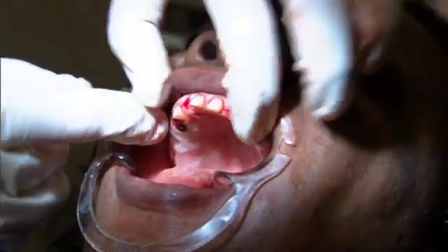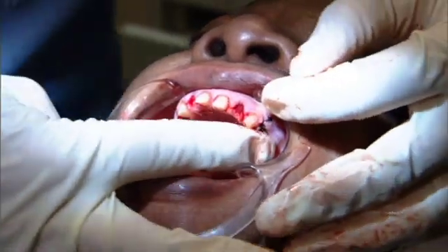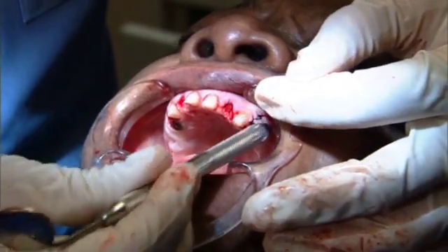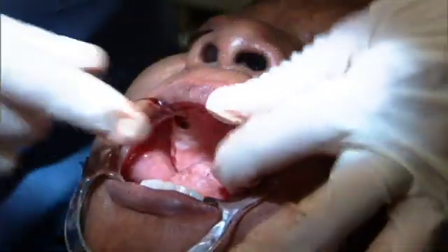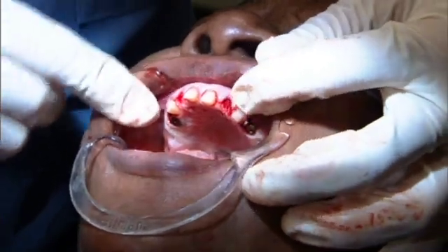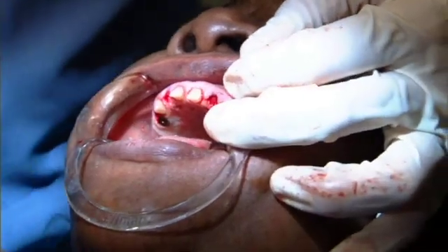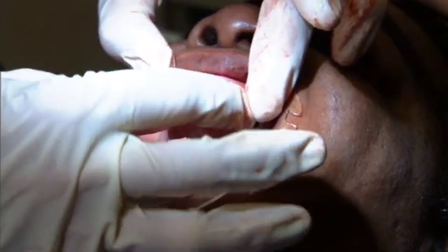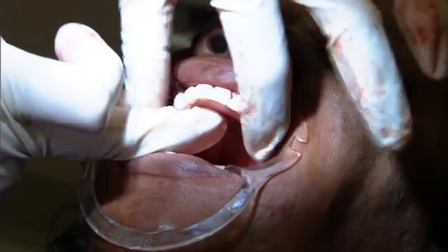Alrighty then. What we've done now is we've gotten our implants placed. We had to elevate a flap to get the root tip out on this left side, which was really good because we saw a flap procedure on this side, and then we were doing a flapless on this side. We were able to get 35 Newton centimeters plus torque on both sides, and so I feel real good about the fact that those are going to heal in just right. Now all we've got to do is get our provisional relined. We'll try our little provisional partial to see if we fit good.